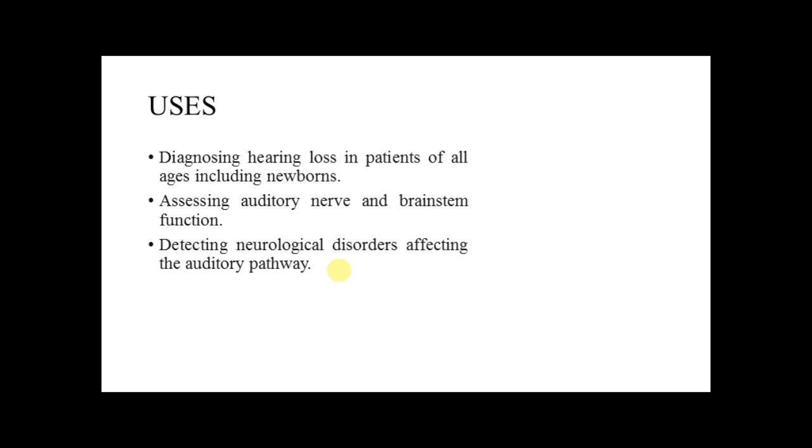Uses: it is mostly used for diagnosing hearing loss in patients of all ages, including newborns, assessing auditory nerve and brainstem function, and detecting neurological disorders affecting the auditory pathways.